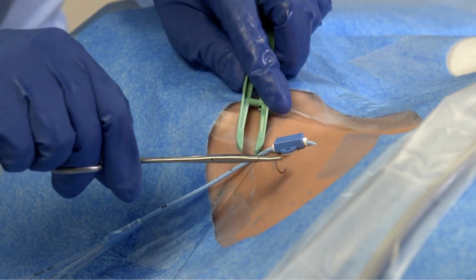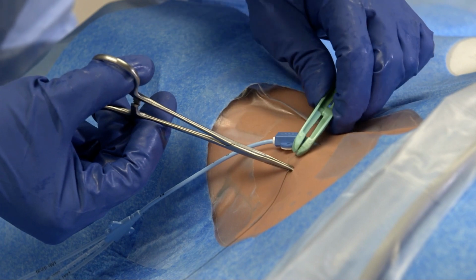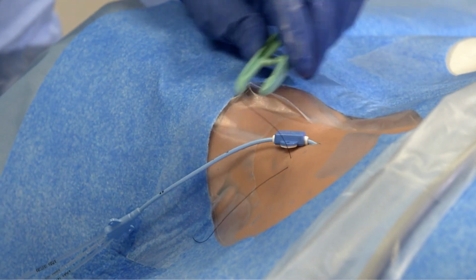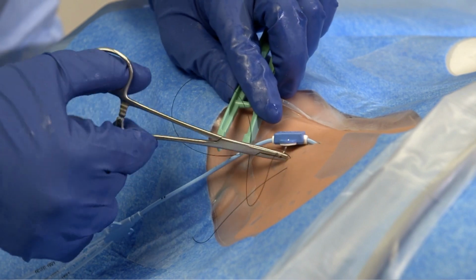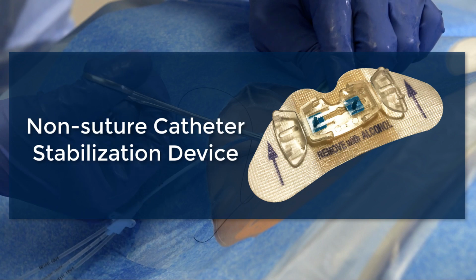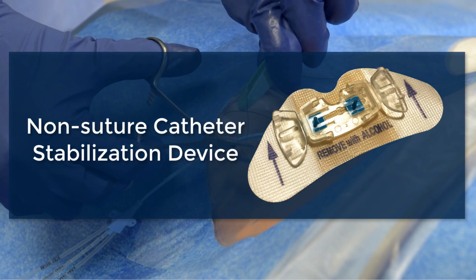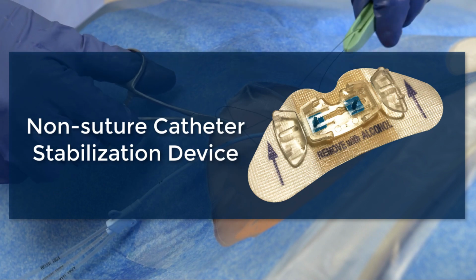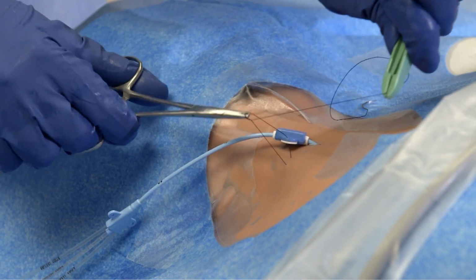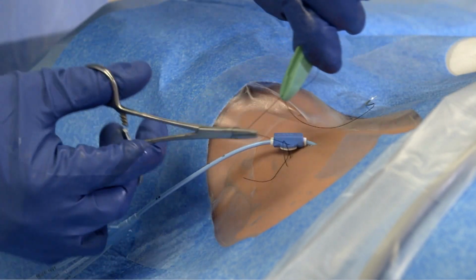Suturing the central line in place carries a higher risk of exposure in comparison to the other steps in this procedure. To help minimize the risk of a needle stick injury, it is recommended to use a curved needle and needle driver. Alternatively, if your institution's policy permits the use of a non-suture securement device, it can be used to avoid the risk of a potential needle stick injury. Additionally, always be mindful of the location of sharps in the work area throughout the central line insertion procedure.